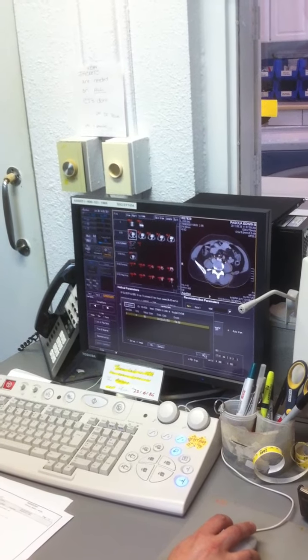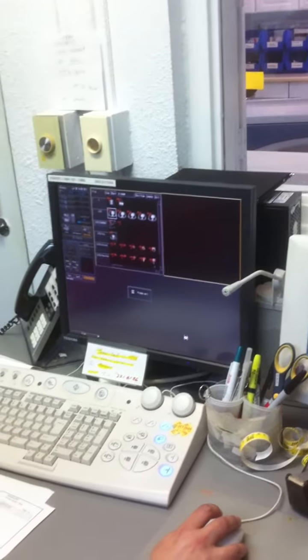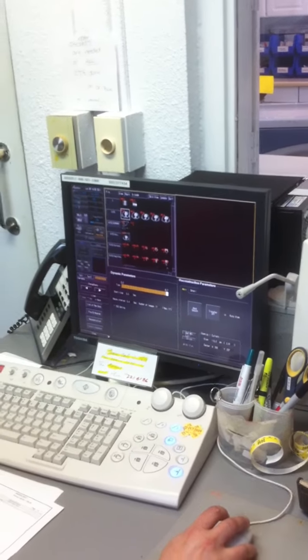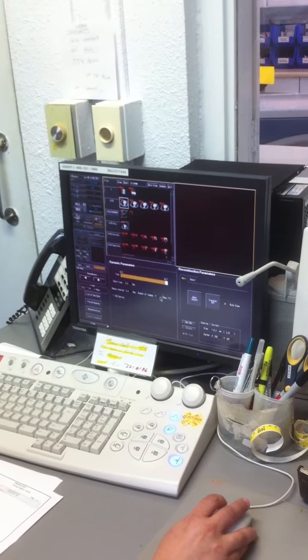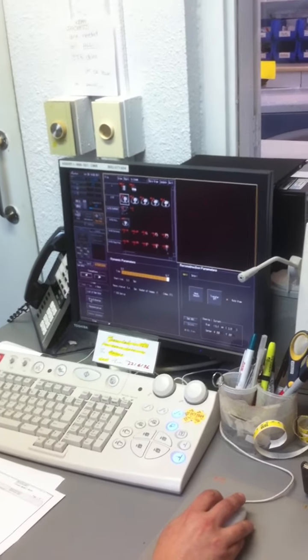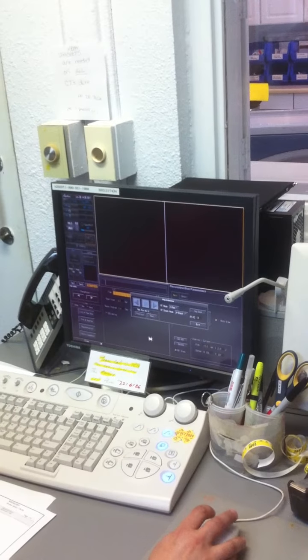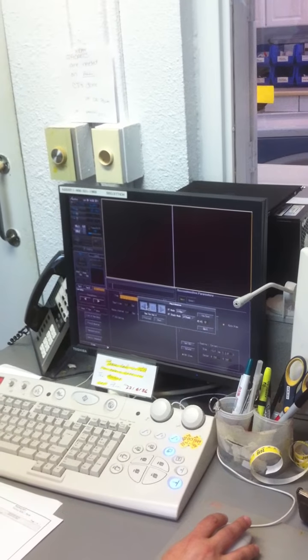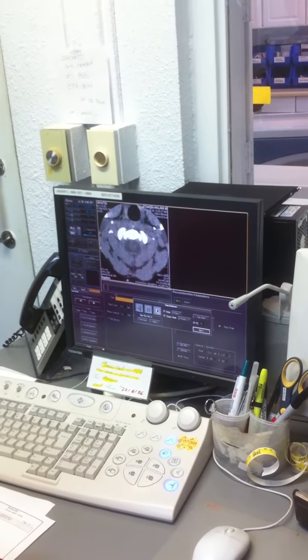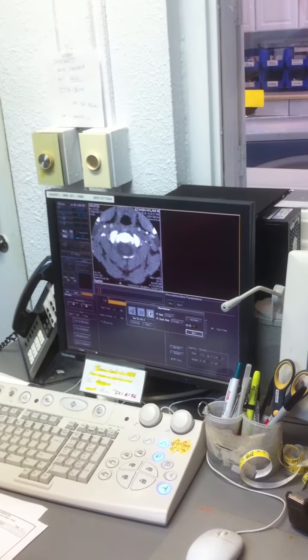Then I'm going to hit OK here on this. And we have 6 seconds of actual Sure Start time. So I'm going to hit play in reverse. It gets rid of the box and gives you VCR buttons. And now we can play it back. Oh, that's cool. There's the blush. Good check. Yay.